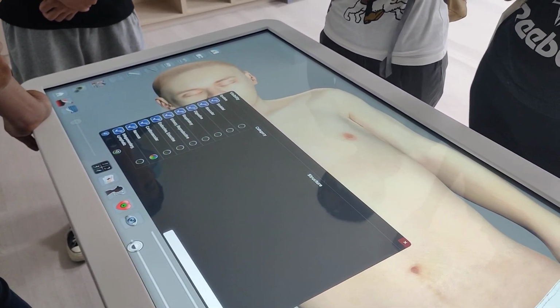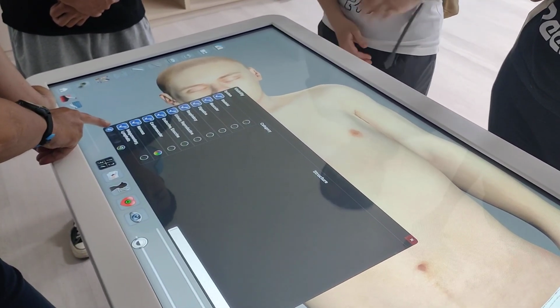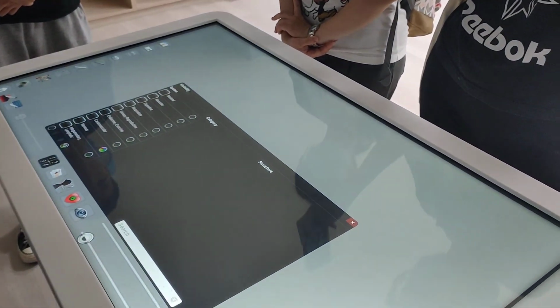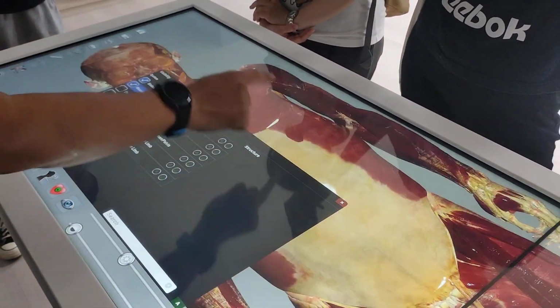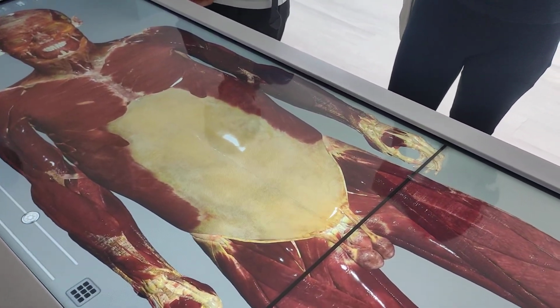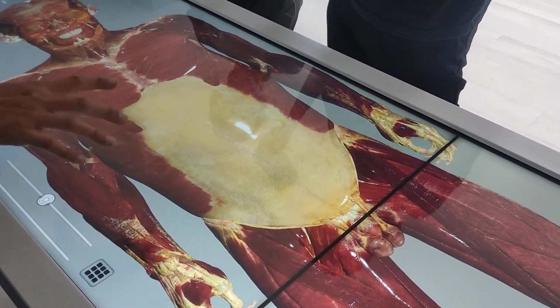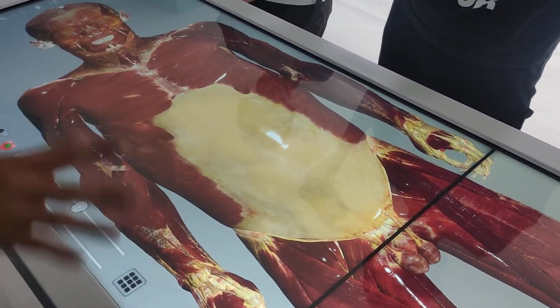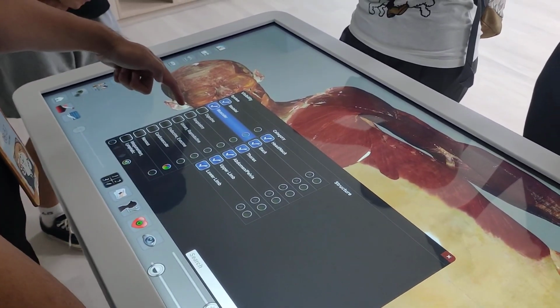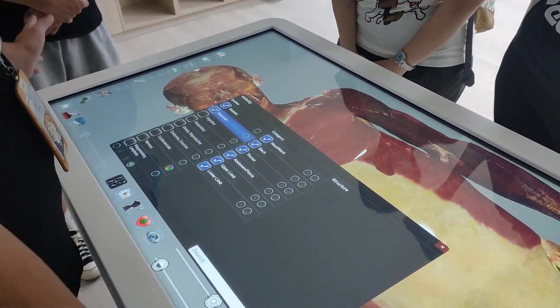And if you want to see the musculoskeletal system, you can press this and everything is gone, right? And if you click here, then the skeletal system and the muscular system can be restored in the cadaver, but not other systems. So you can see digestive, respiratory, urinary, endocrine, whatever else are all removed.